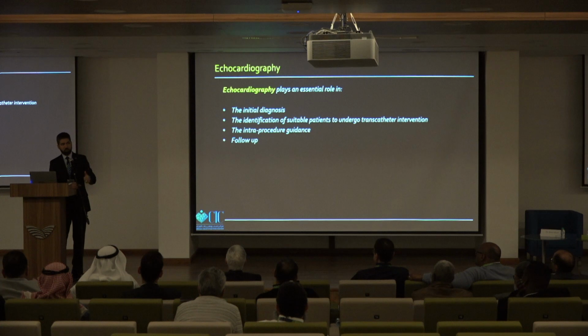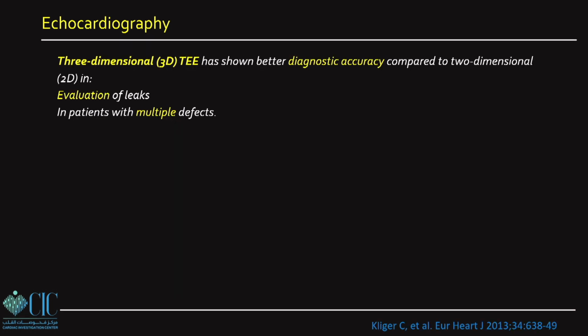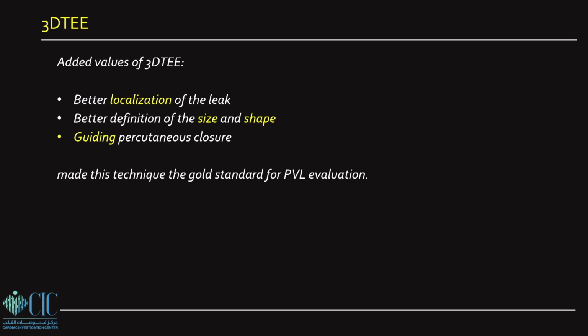First of all, to diagnose the patient, to detect the severity of the paravalvular leak, and to check if it is suitable to be closed percutaneously, and of course, inside the procedure in the cath lab and follow-up. We are speaking about 3D, so 3D has a lot of added values, as we will see later on in many things, especially in multiple leaks, in defining the shape and size, the localization, the guidance of the procedure, and so on.